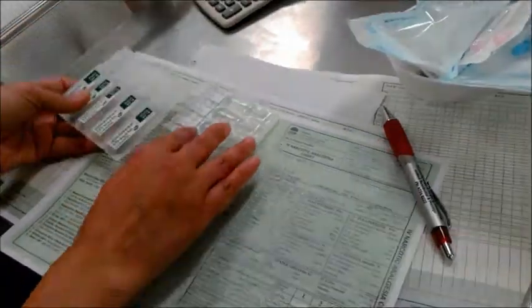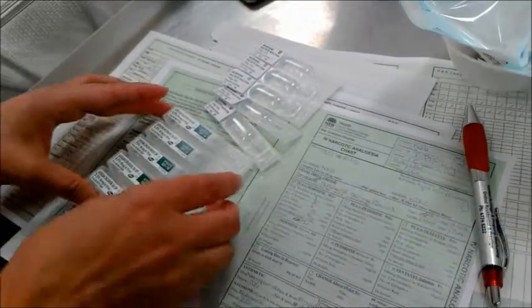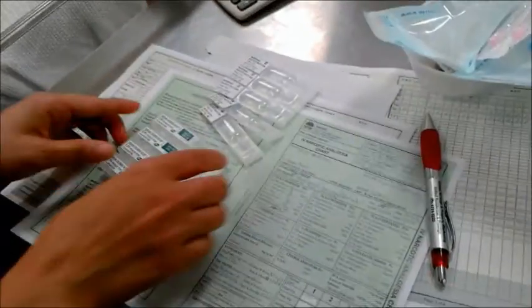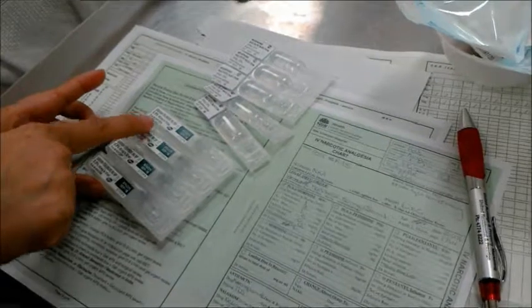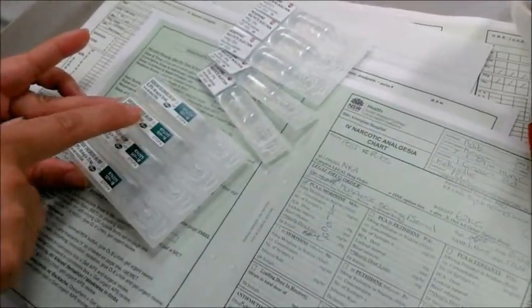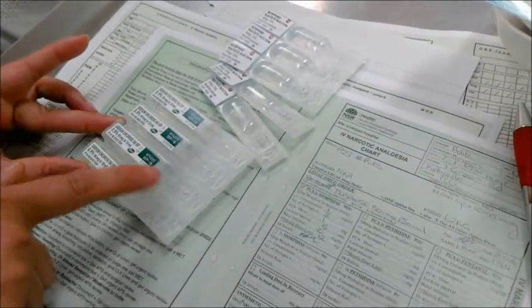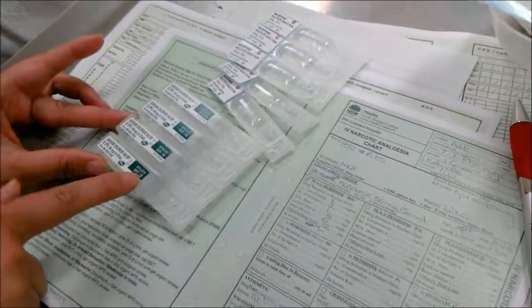Also, I have to mix this medication with the normal saline. I've got 4 normal saline because I have to make it up to 50 ml. Okay, so all of them are sodium chloride 0.9, expiry September 18.